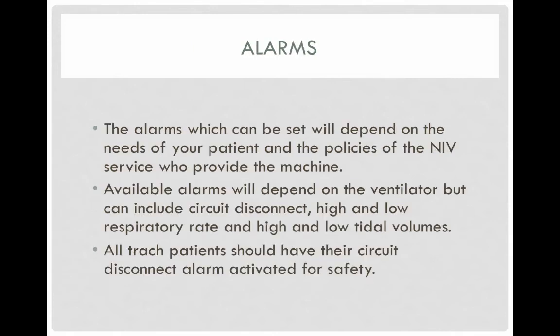The alarms are critical on these machines, primarily because we are working with patients in some amount of ventilatory failure, meaning they cannot necessarily sustain adequate blood gas values on their own. If the patient removes the mask or the tubing becomes disconnected, they can quickly have an accumulation of CO2 and a quick drop in oxygen saturation. So some amount of alarms are critical.